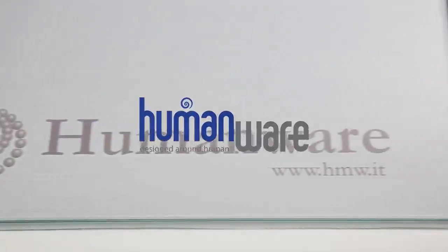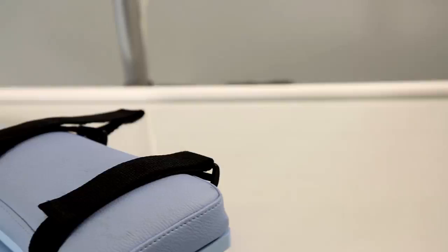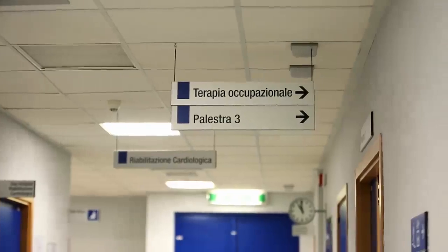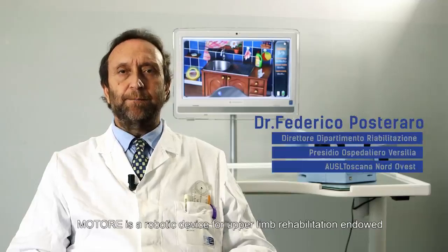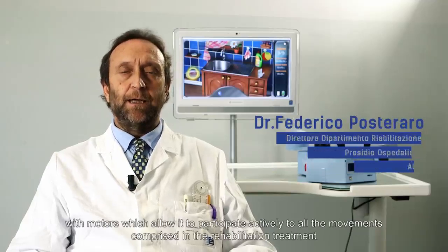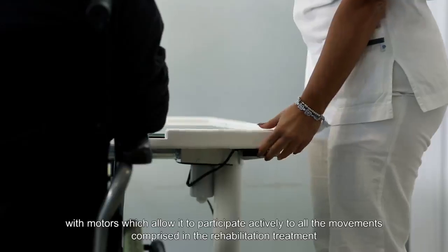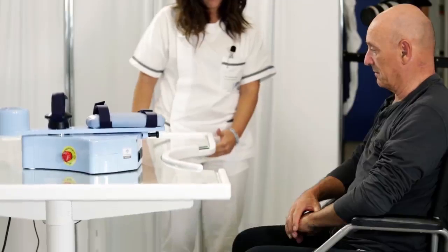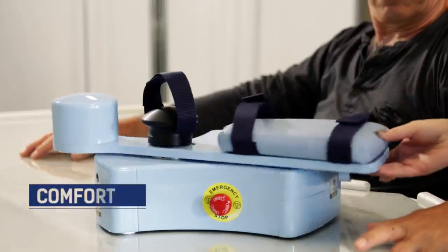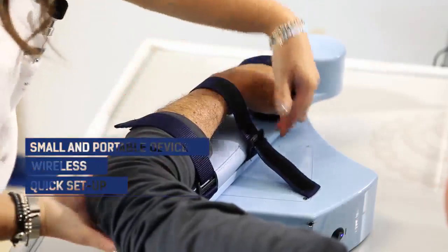Humanware, a research company which produces neurological rehabilitation devices, presents Motore. Motore is a robot for neuromotor rehabilitation. According to the patient's needs, the robot can assist or oppose their movements.